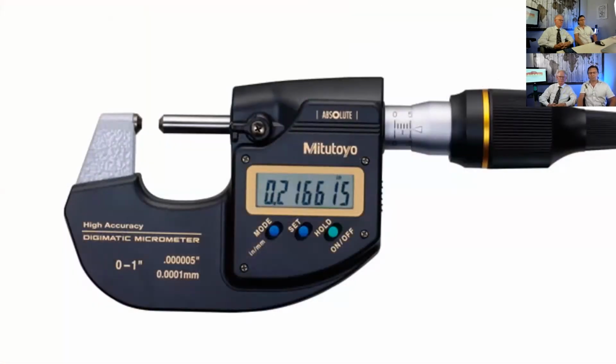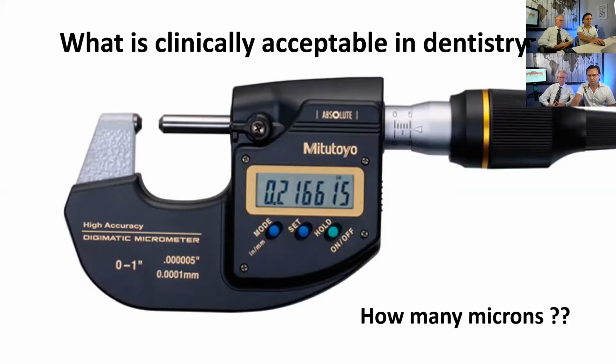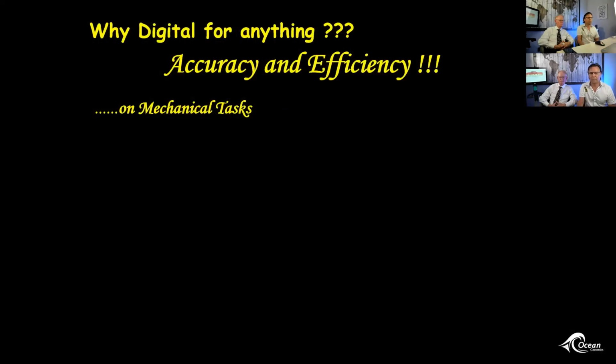So let me ask everybody, what is clinically acceptable in dentistry, micron-wise? Well, right now, anything 40 to 50 microns, if it's within that, it's clinically superior accurate. So whether it's a contact, a margin, cement gap, a bite, all these physical attributes that have to come together, our goal is to be within 40 to 50 microns of accuracy or better. 40 to 50 microns.